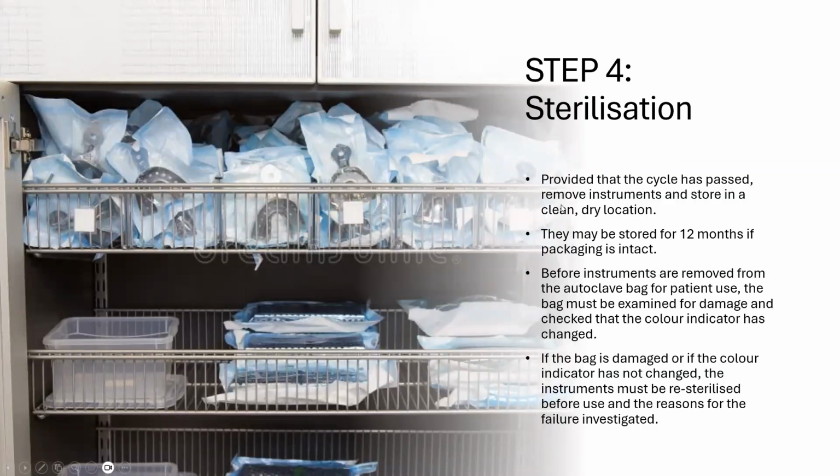We are discussing sterilization, step 4. Provided that the cycle has passed, remove instruments and store in a clean, dry location. They may be stored for 12 months if packaging is intact. Important point from exam point of view.